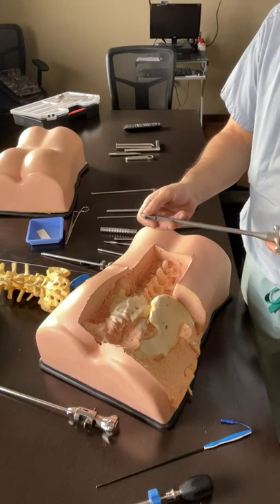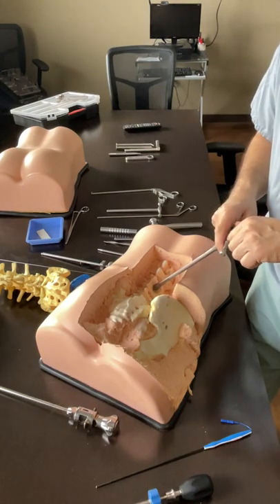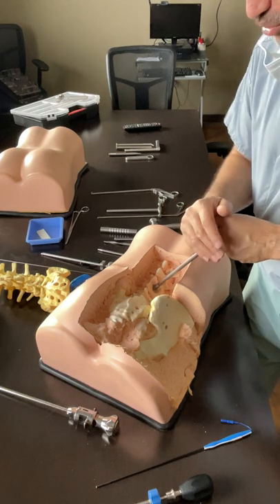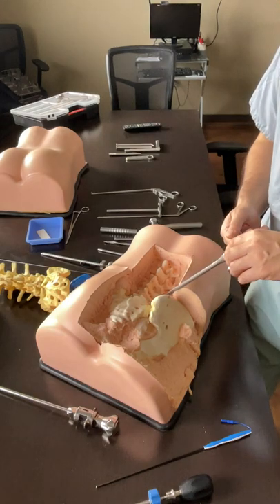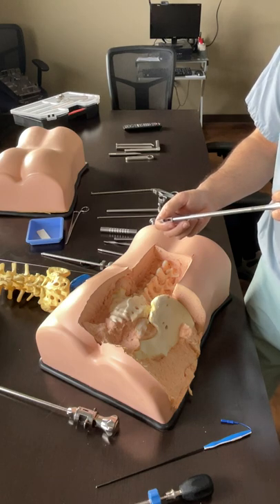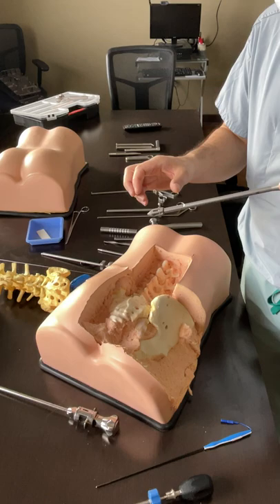Sometimes the cage is put in the wrong way - you think you're in the correct way, but you're not. With this cage, only with the titanium cage, you can overcome the force and turn it the correct way once you're in. Never try that with the PEEK cage. I used to go through Kambin's triangle with bigger cages turned sideways for a smaller profile, but I found that has really no effect on any outcome. These days I just go the way I'm going to go in, because it opens up its own way - but you have to pass that segment really quickly.